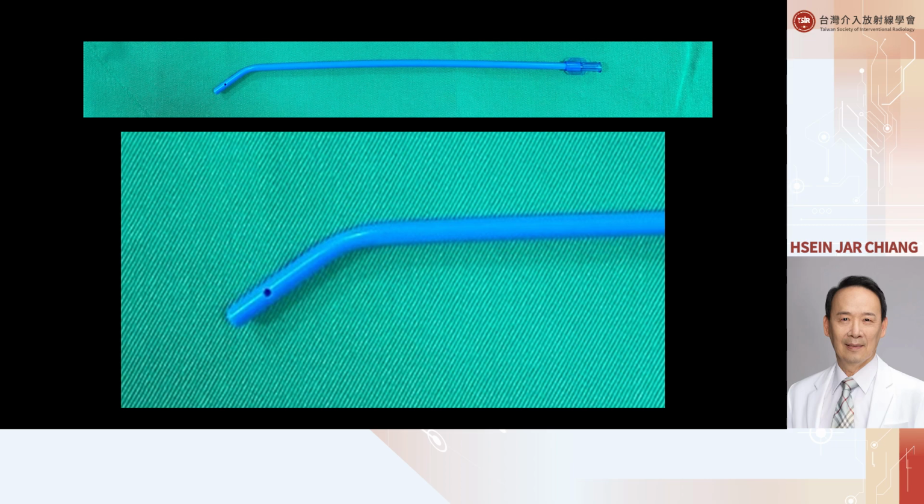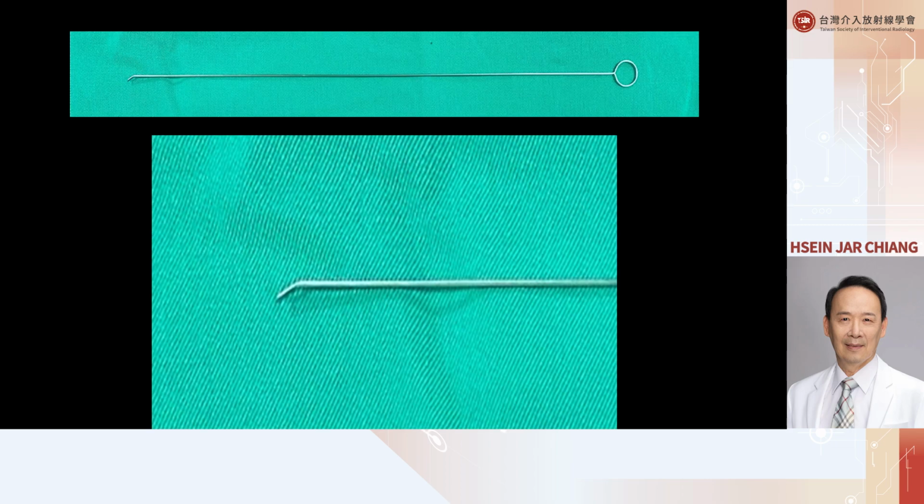We can aspirate the excessive bile and contrast medium to make it easy to look at the stone on the fluoroscope. The metal stick has a curve at the tip. You can manipulate it, change its direction to make a big destruction area of the stone. And the stick has a blunt end.